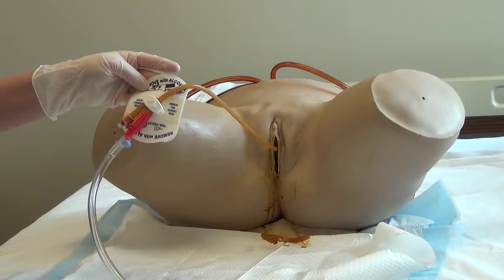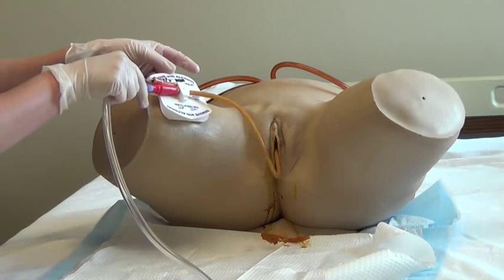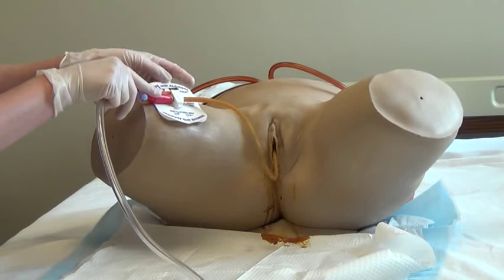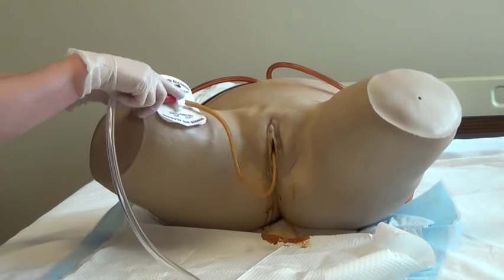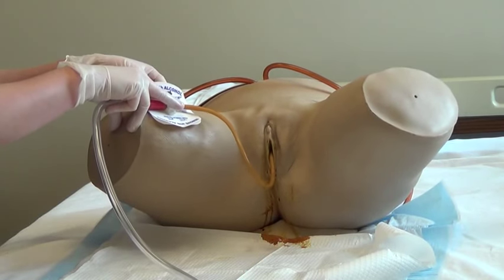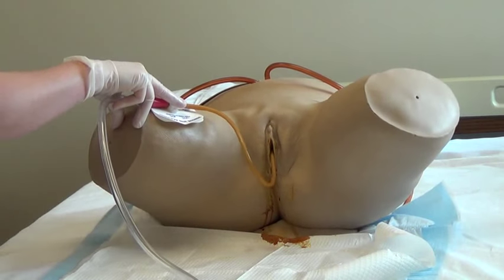Align the Statlock device over the securement site, leaving 1 inch of catheter slack between the insertion site and the device retainer. Make sure the leg is fully extended. While holding the retainer to keep the pad in place, peel away the paper backing one side at a time and place tension-free on the skin.